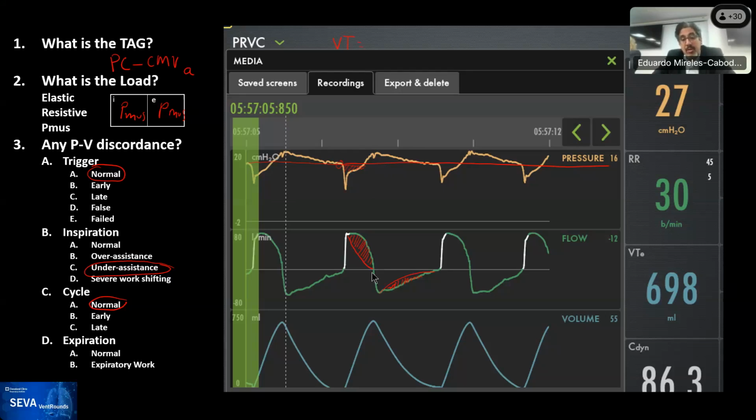And that's what at least the airway pressure is showing when we do that occlusion pressure, which in prior publications has been demonstrated to correlate pretty close to the esophageal pressure measurement. And there's some variables for adjustment about what you actually see in the lung, but I would say that this, by all measurements of effort in a patient is pretty elevated.